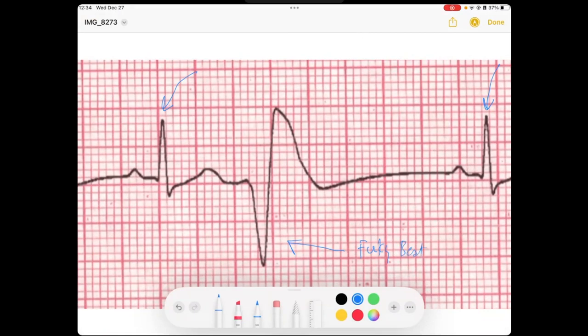And so if we look at our normal beats, we see we've got these pretty P waves. We've got our narrow QRS that is under 120 milliseconds. We've got this pretty T wave. And then we've got this funky looking beat right here.